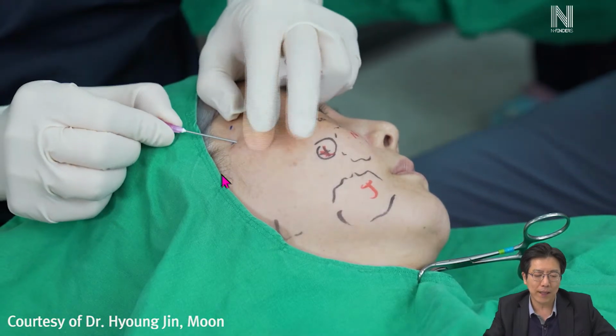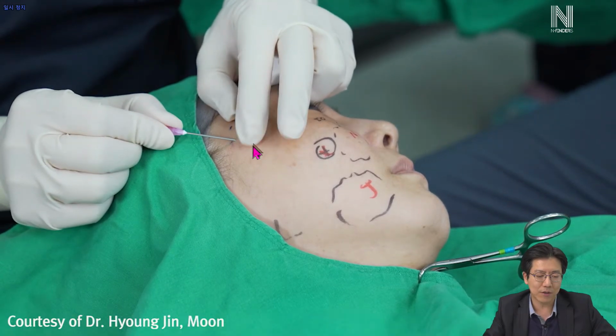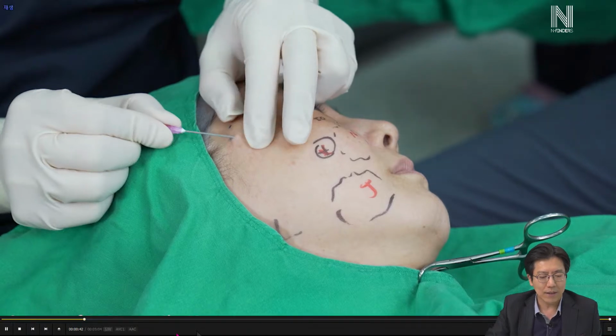So I make a hole with an 18 gauge needle. I always apply this tap-tap procedure, as you see. I'm a beginner, so I cannot control the needle very well. So I just put the needle on the skin and use my opposite hand to apply tap-tap to make a hole. Then you can control your strength to put the needle through the skin. Then you can prevent vascular damage and control the power very easily. So I like this tap-tap procedure.